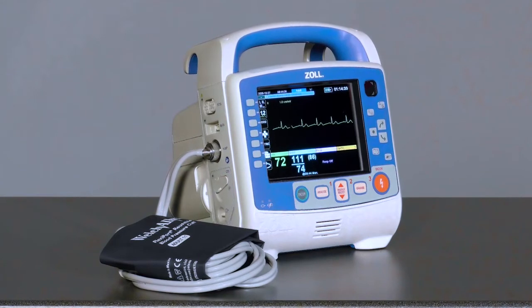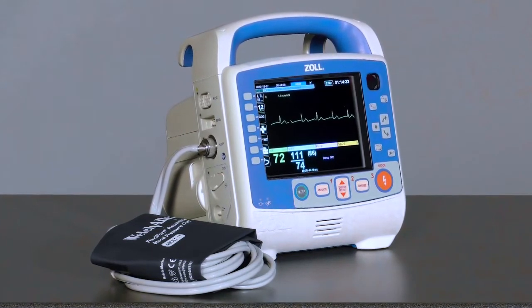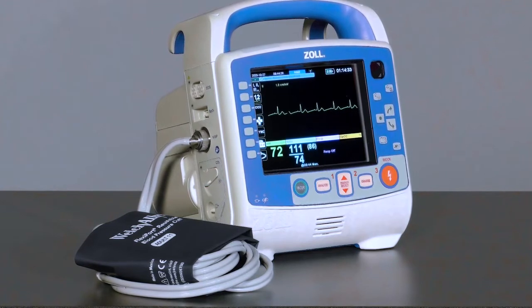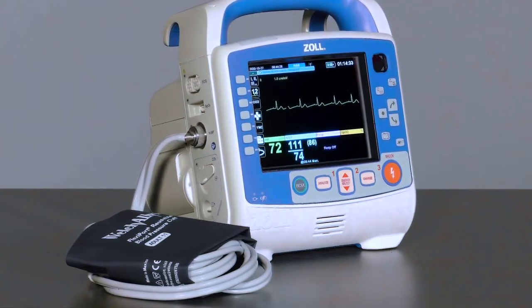The X-Series Advanced utilizes Welsh-Allen Smart Cuff technology for non-invasive blood pressure monitoring. This system employs a dual-lumen tubing with easily interchangeable cuffs to be selected based on patient size.